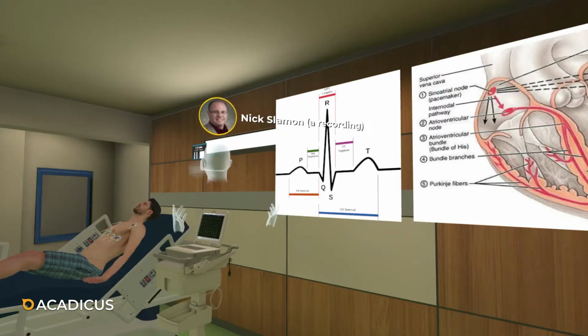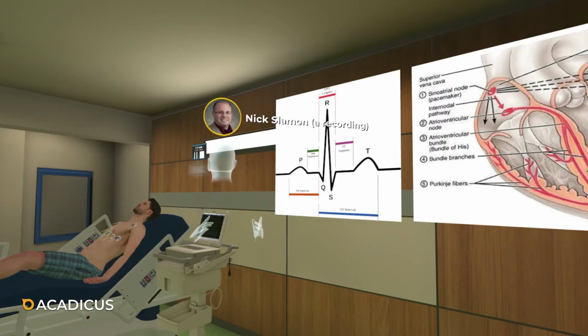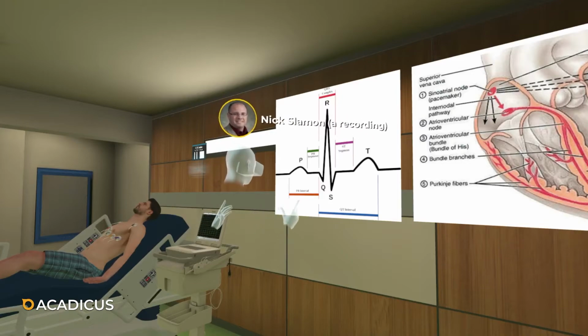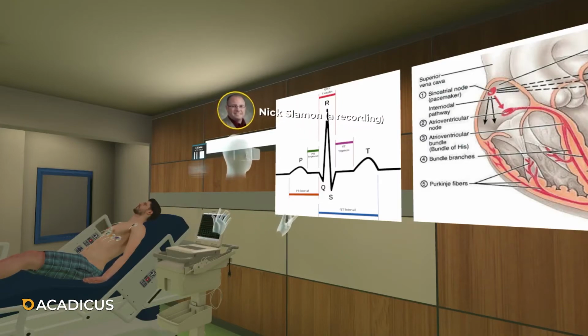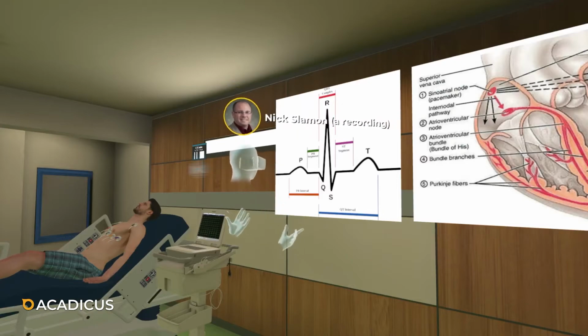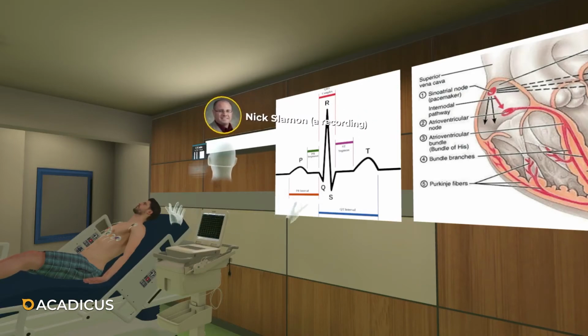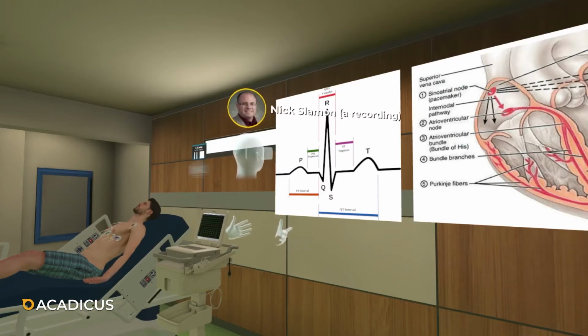It's not really left or right, although depending on what lead you're looking at, you could focus in on a certain part of the heart and say, those are the anterior leads, that's the anterior part of the heart, or that's the left lateral part of the heart. So when you have 12 different pictures of the heart's electrical activity, you can get an idea of where exactly we are looking. That becomes important in adult medicine, of course, for ischemia. If you have lack of oxygen to a certain part of the heart, the EKG in that part of the heart is going to change, so you can pinpoint and narrow in. But our QRS complex in general represents the depolarization of the ventricles.